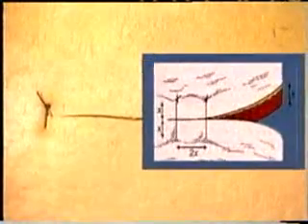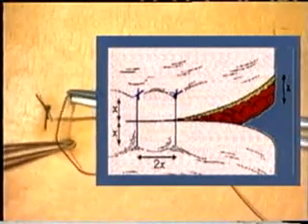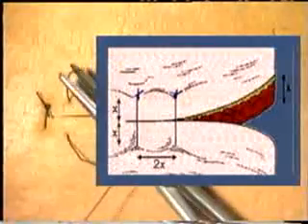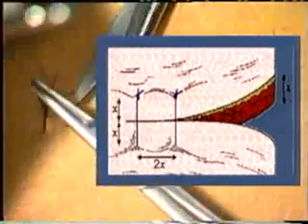Secure a standard reef knot, either using the one-handed technique or the instrument technique. Cut the suture to such a length as will allow it to be grasped for subsequent removal. As a rule of thumb, the distance from the edge of the wound should correspond to the thickness of the tissues being sutured. Each successive suture should be placed twice this distance apart, approximately double the depth of the tissue being sutured. Continue to insert your sutures in this manner across the entire wound.